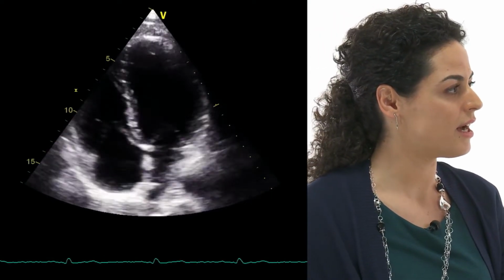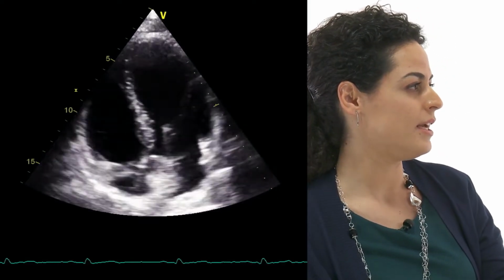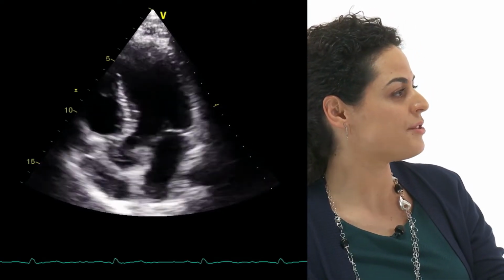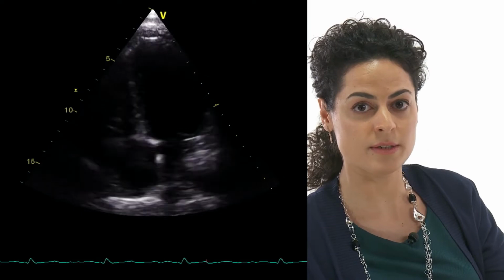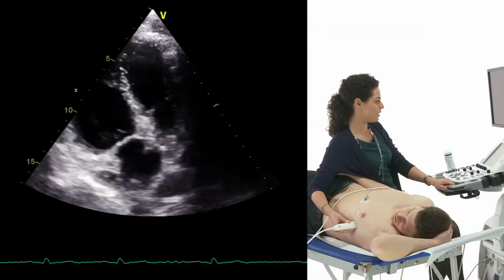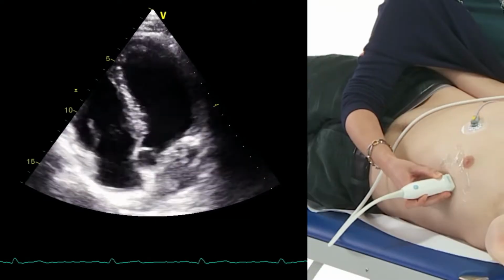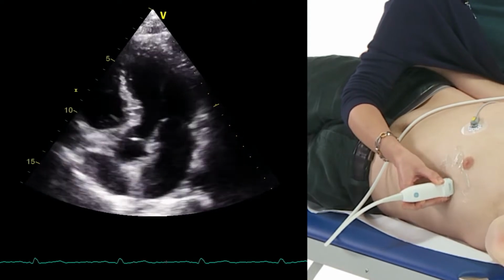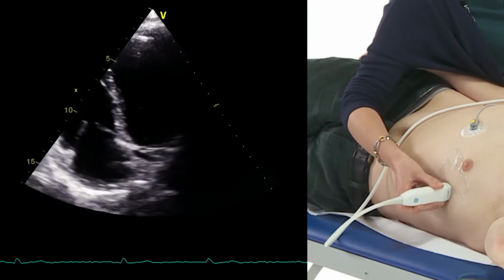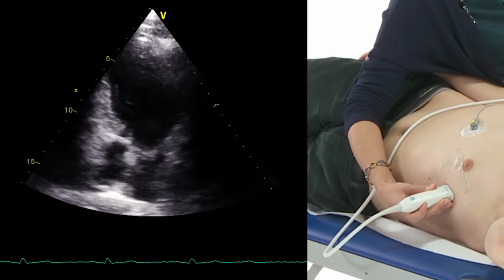And then I'll teach you the last movement you can do. It's mainly for the right ventricle, as I told you. Sometimes the ventricle is completely normal in your patient, but you image it as extremely big. And what does it depend on? It depends on the probe. So actually, with a small rotation, you can see what happens to the right ventricle. It gets smaller, and gets normal size, gets bigger.